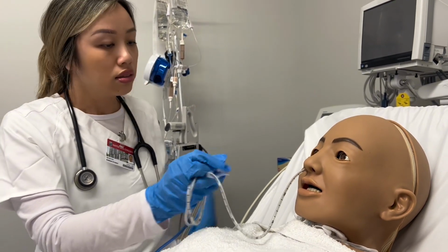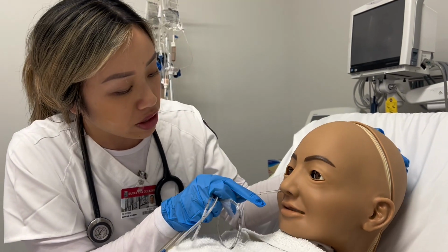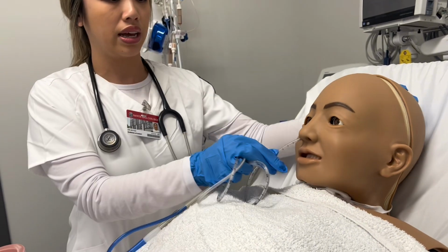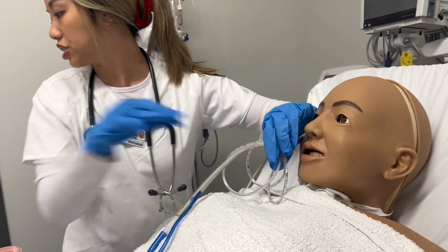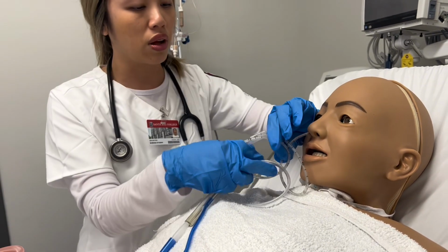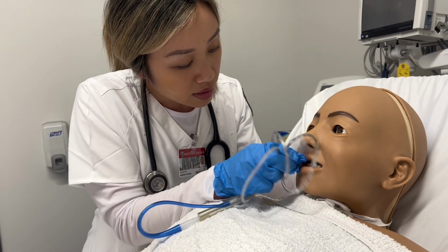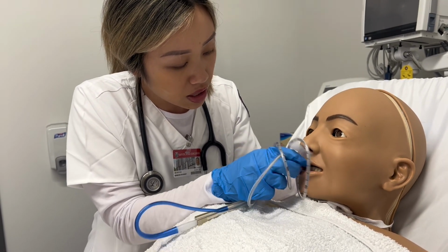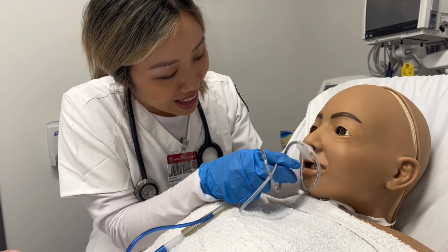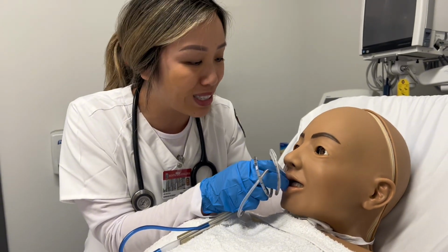Okay. So then I'm going to have your head go from chin to chest. And then at this time I would give my patient that cup of water. Okay, and then go ahead and swallow for me. Okay, 1, 2, 3, swallow, swallow, swallow. Okay, so it looks like this mannequin's not really letting me go forward, so I'm just going to stop here.